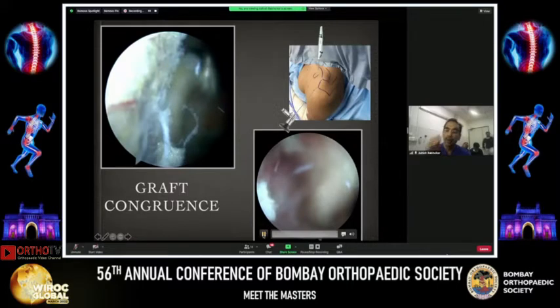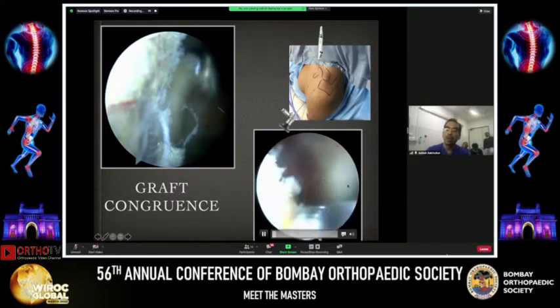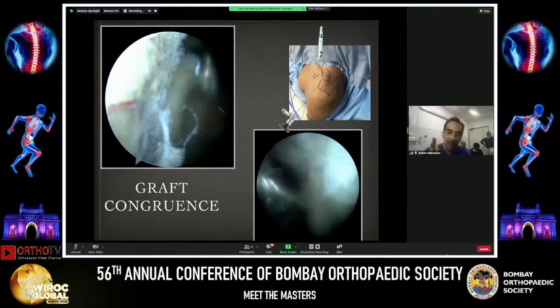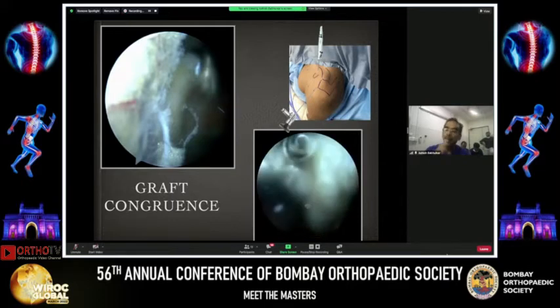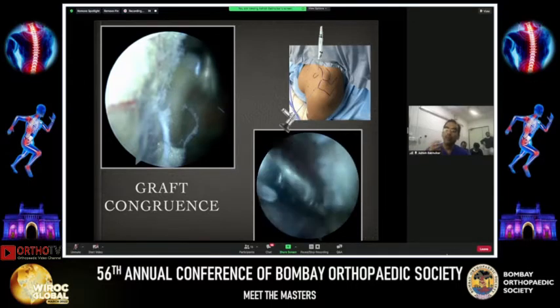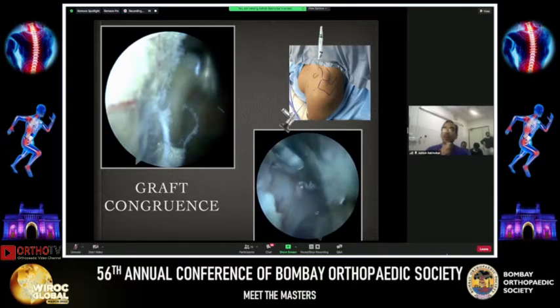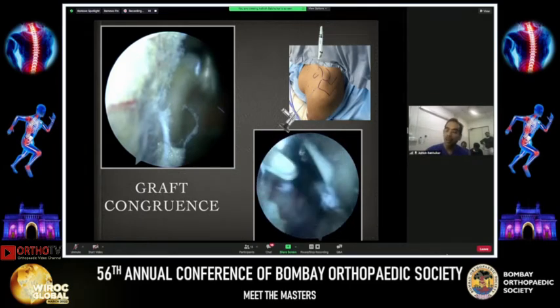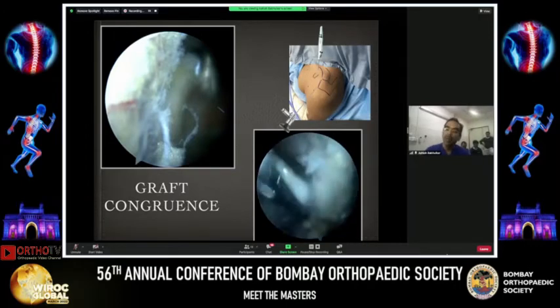For graft congruence, you use the same bur now to prepare the glenoid. You separate the subscapularis away from the glenoid and bring in your bur to flatten that surface. If your glenoid is straight and flat — typical for 15-20% glenoid bone loss — all you need to do is lightly decorticate. But sometimes a bone fragment has malunited and creates a bump, precluding the coracoid from sitting flush, in which case you use the bur to flatten and match both surfaces.